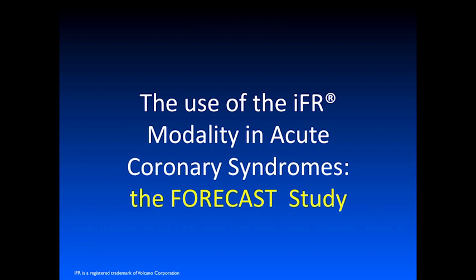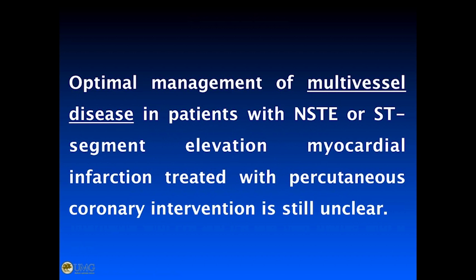Just a few slides on the use of iFR in acute coronary syndromes to interrogate the non-culprit lesions, and it is my pleasure to present some of the FORECAST study that has been done in our institution. It is well known that optimal management of multivessel disease in patients with non-ST elevation or ST elevation myocardial infarction treated with percutaneous coronary intervention is still unclear.